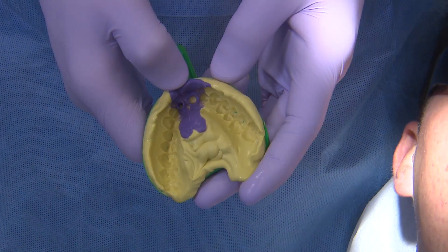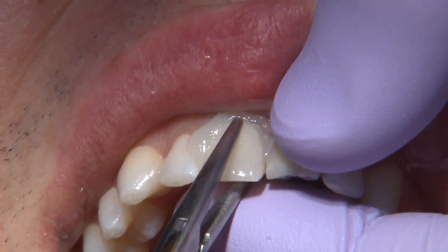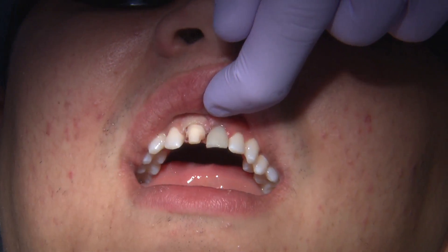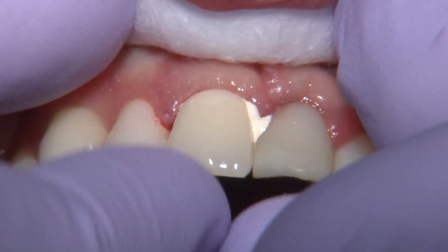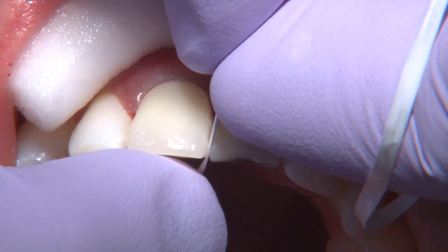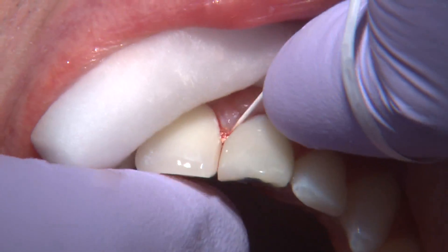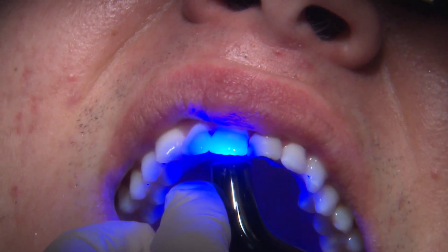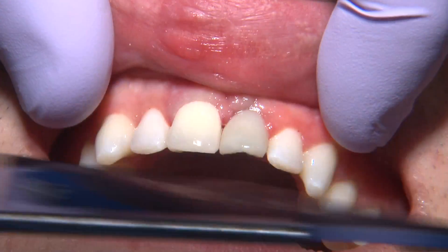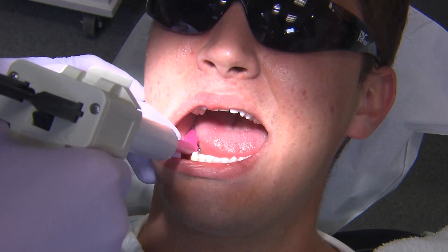I go ahead and reline the BioTemp and trim it, and the patient is ready for delivery of the final restoration at the next visit. Once I reline the temporary and trim everything with clean margins, I'll cement. You want to be careful that cement doesn't creep down to the shoulder of your implant, so make sure you clean the temporary cement really well. We also use a radiopaque temporary cement so you can take a radiograph and verify no cement was left behind — very important for the tooth adjacent to your implant.